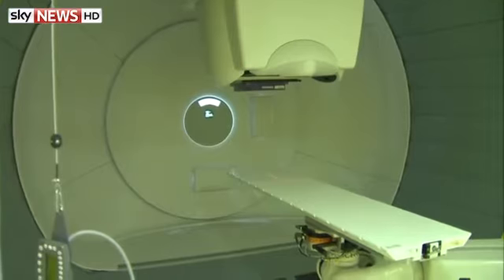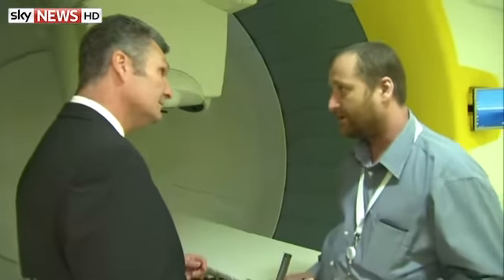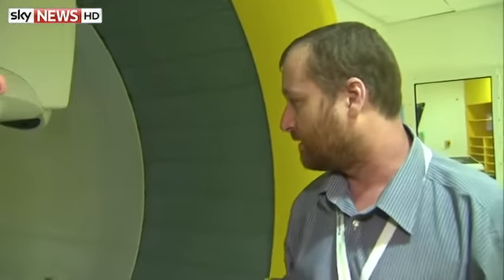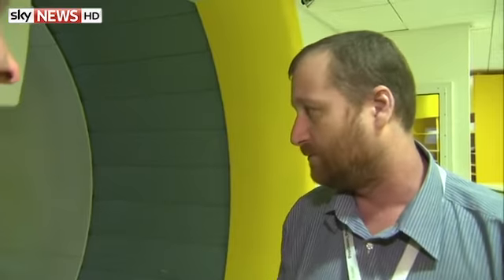And all of this takes 2 minutes and then the treatment's finished? Well, yeah, the actual treatment takes, let's say, 2 to 3 minutes. You also have to take into account the loading time and positioning time. The whole time slot for one patient usually takes 20 minutes. If it is a child under anesthesia, for sure it takes much longer, let's say 40 minutes up to 1 hour. And all of that, of course, with protons travelling at 150,000 kilometres a second.